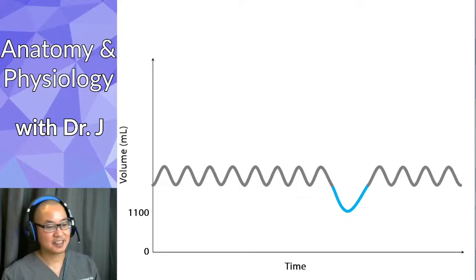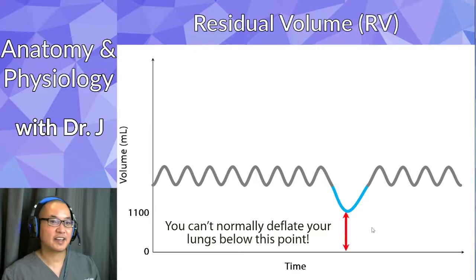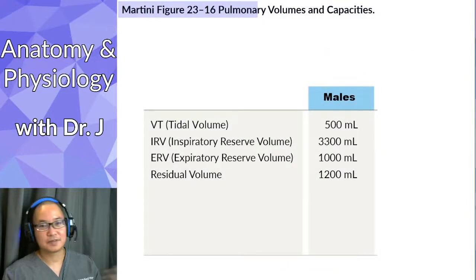that for a spirometry. But my point is that you always have that leftover volume, even if you try to squeeze as much air out of your lungs as possible. This residual volume is why you can't actually measure your total lung volume with a spirometer. Based on your height, weight, and other parameters, they might have an estimate of residual volume, but a spirometer alone can't measure this volume over here. So whatever the minimum is, the lowest point during a forced exhalation, that's the residual volume, where it crosses the graph over there. Okay, so we talked about the volumes.